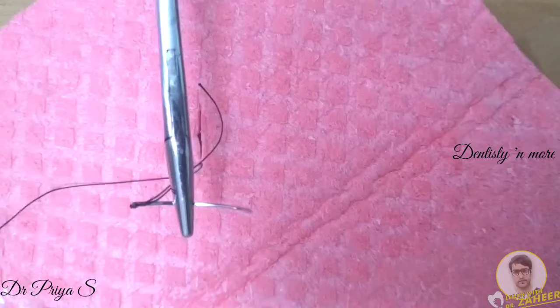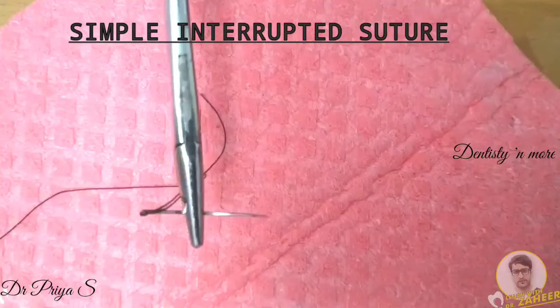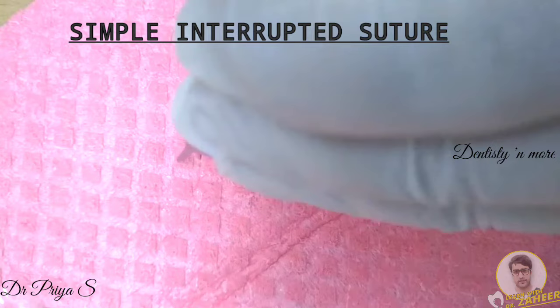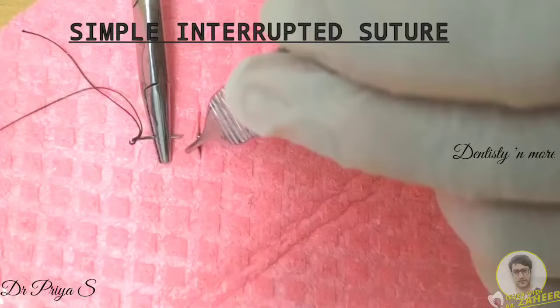First, you load the curved needle with suture material in the needle holder, which is held at the junction of the distal two-thirds and proximal one-third. Lock the needle holder to keep the needle fixed and stable. Lift the tissue on one side of the wound gently using a tissue holding forcep and pierce it at a 90-degree angle, 3 mm away from the wound margin.